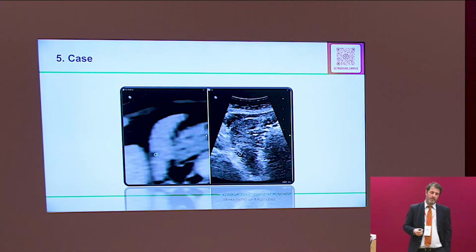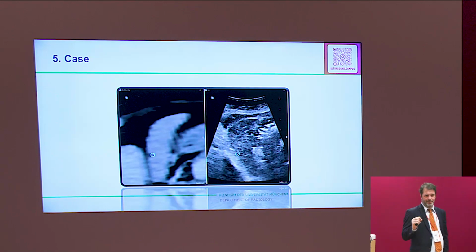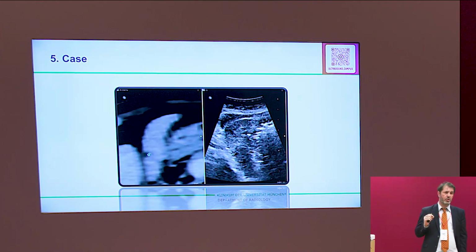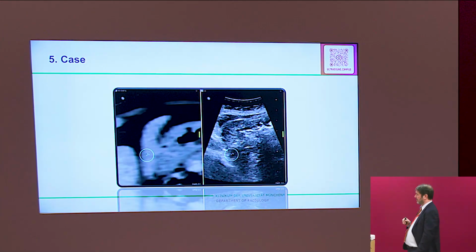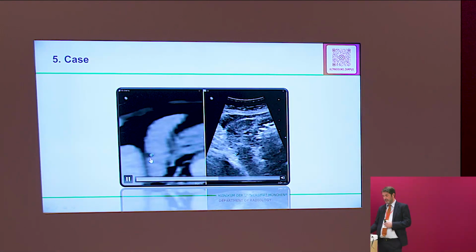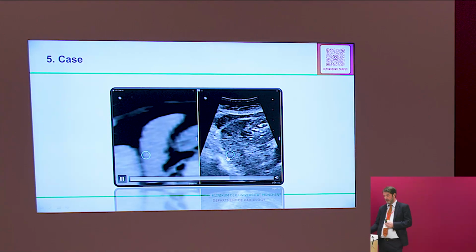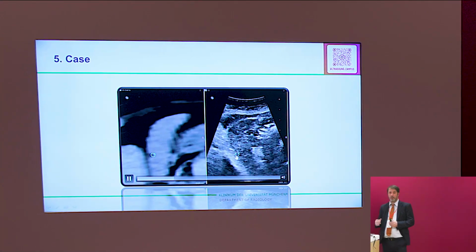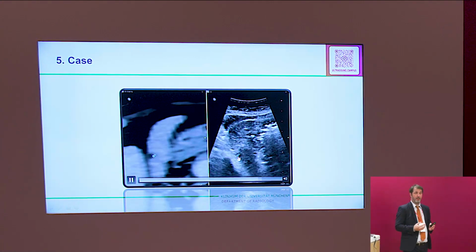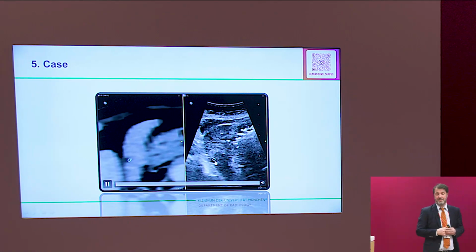Every time when we do fusion, we speak about, most of the time, a very tiny lesion. That's the most challenging lesion. You see, there is a very, very tiny lesion here. And this is the lesion also in grayscale. What color does this lesion have in grayscale? Is it gray, is it black, or is it white?